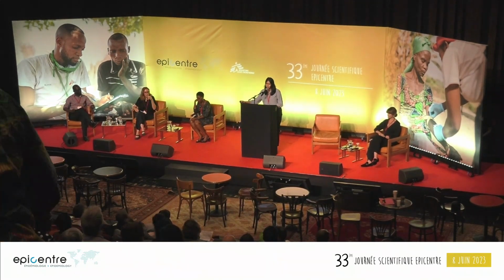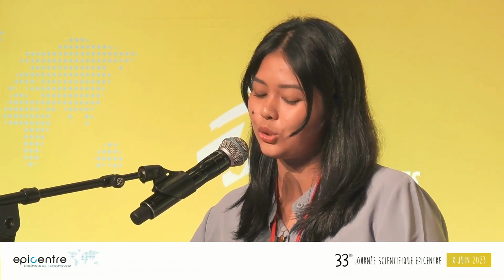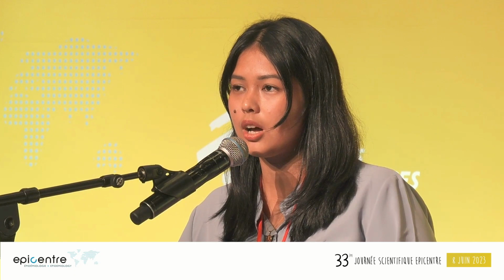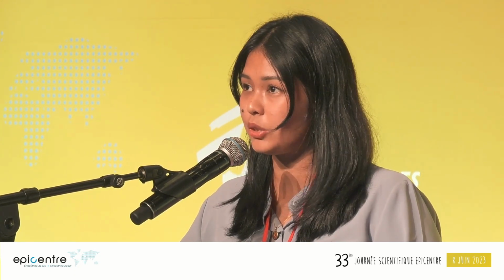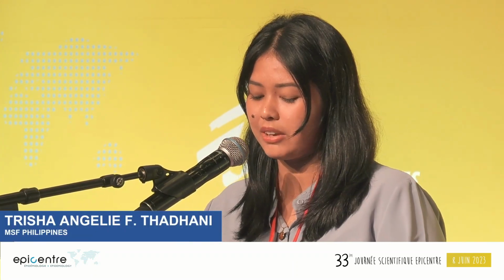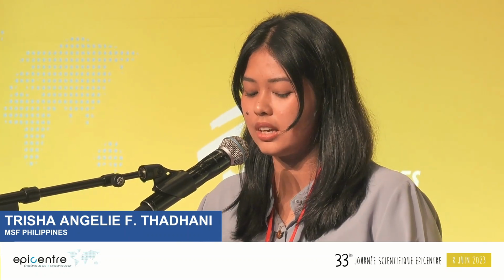For the brief background, in 2021, the WHO TB guidelines released a conditional recommendation for computer-aided detection, or CAD, in the place of human readers for TB screening and triage among people aged 15 and above. So for CAD's performance, it's been found to be largely at par with radiologists. However, its accuracy may vary according to the population, which is why local calibration is necessary.